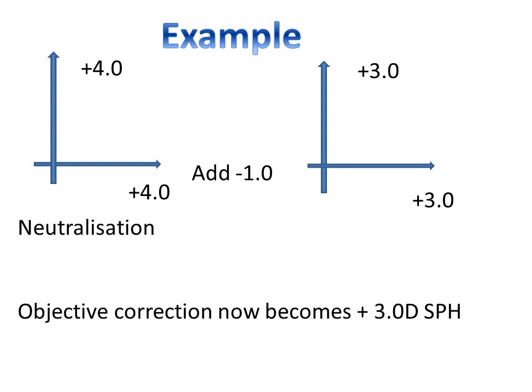So when you are giving the correction according to your calculation, that is objective correction. Subjective verification is nothing but putting the same calculated valued lens in the trial frame and then asking the patient to subjectively observe whether the 6/6 is visible with this particular lens. So subjective verification is done later. Prior to that, we are doing objective correction and calculating how much power we are planning to give to the patient. So in this particular patient, we plan to give +3.0 diopters of spherical.